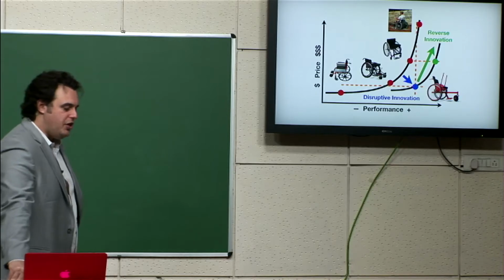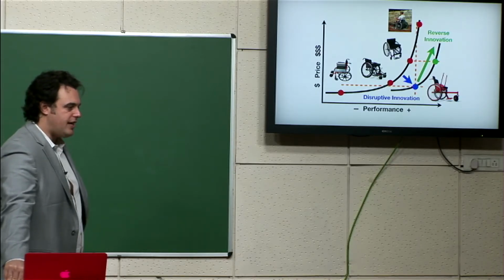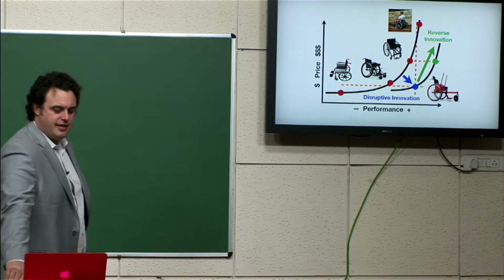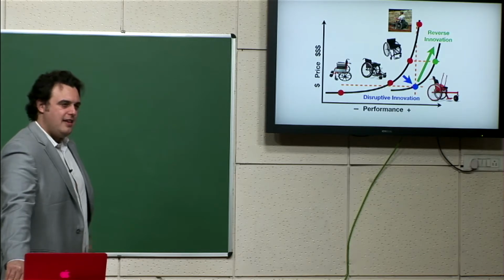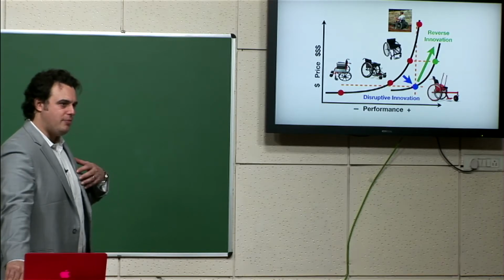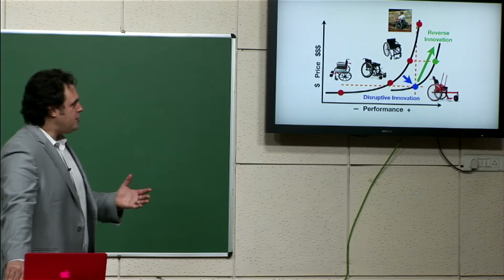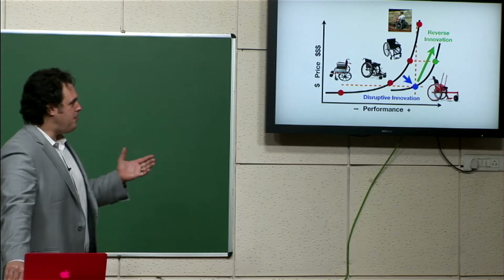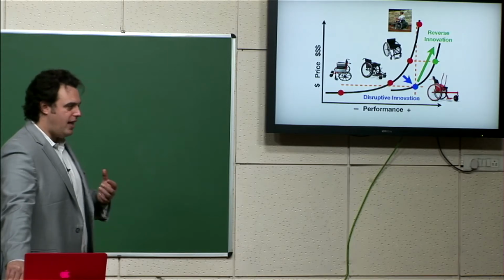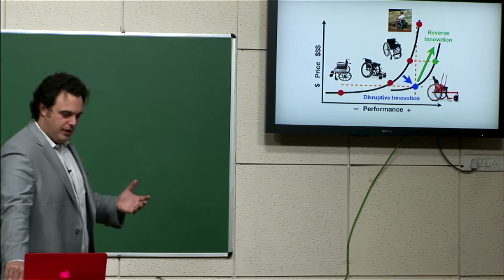wheelchair users in the US and Canada and Europe started contacting us and saying, why would you only make a high performance, low cost, all-terrain wheelchair for developing countries? We want that too. We would love something robust like this, and we can go in rough terrain and we can repair it locally. These same features that you incorporated into the wheelchair for the developing world, we could benefit from too. So what was interesting to us is we had never anticipated or planned to make a US version of our chair, but consumers were telling us there could be value there in doing that.